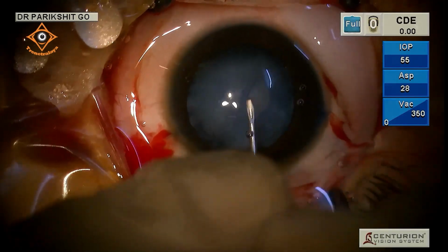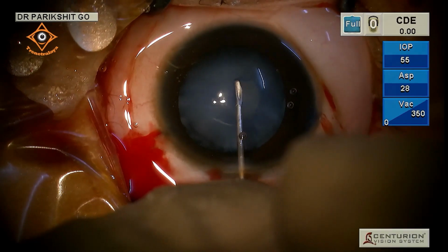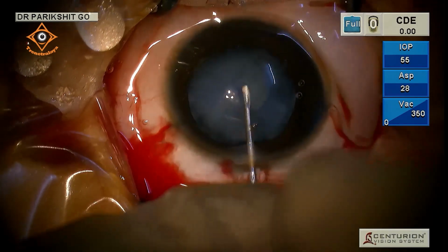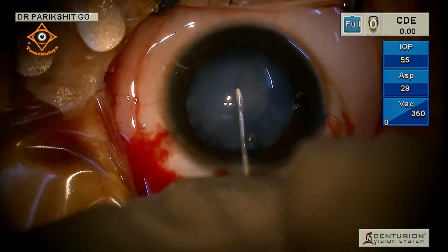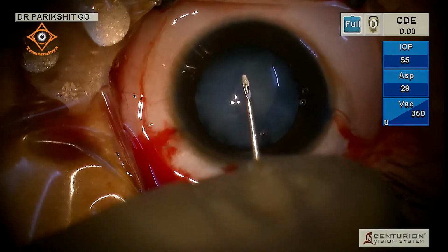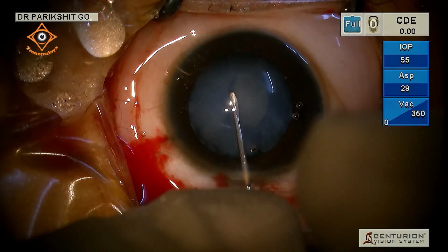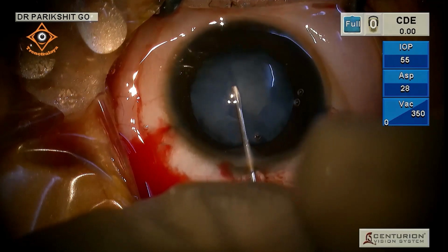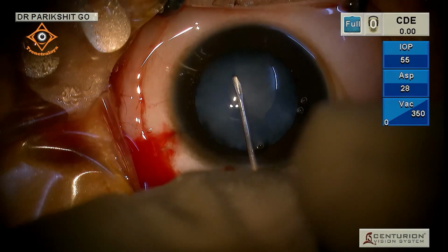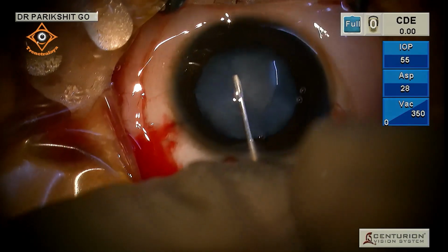So can you see my eye? Is it well centered? Is the illumination enough? Yes, it's well centered. We can see it quite well. And the incision you have used is 2.8 millimeter, I guess? Yes, sir, 2.8 mm. They said here that we could even do it through 2.2, but since I'm doing it in a new place, I thought it's best to err on the side of safety. And I believe in suturing all my side ports and the main port, howsoever small, because the scleral rigidity is much less in a child.